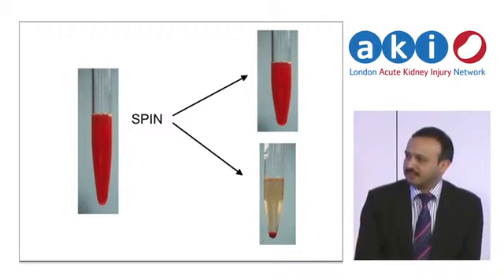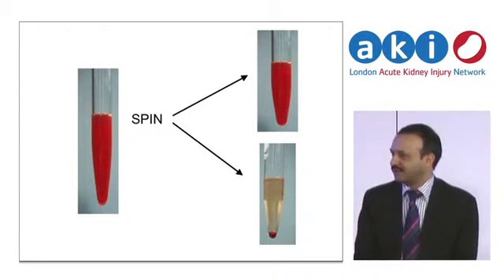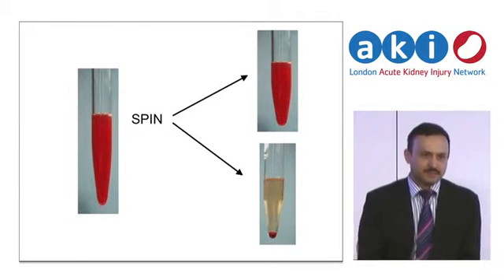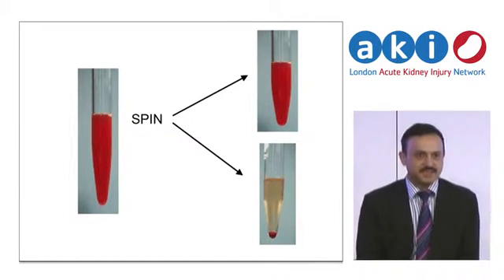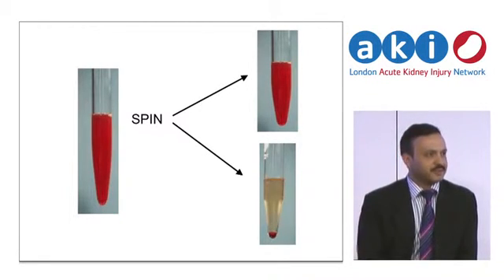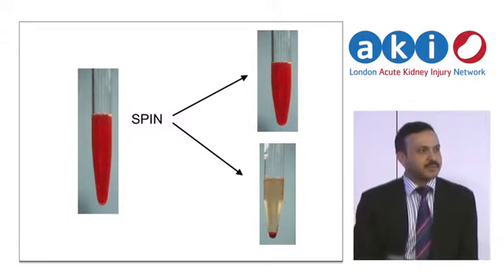So it can be seen in patients with rifampicin, where it's more orangish colored urine. But this patient had AKI purely from rhabdomyolysis or hemolysis. A patient who's got large hemolysis can present with red-colored urine, which is not inside the cells. So if you did a dipstick, it should still be positive for blood.